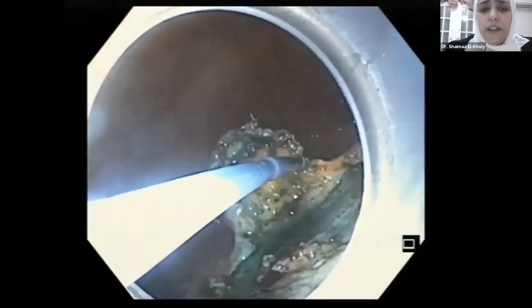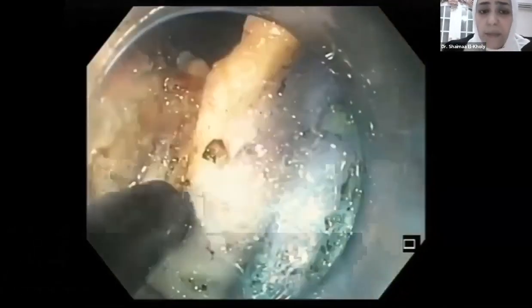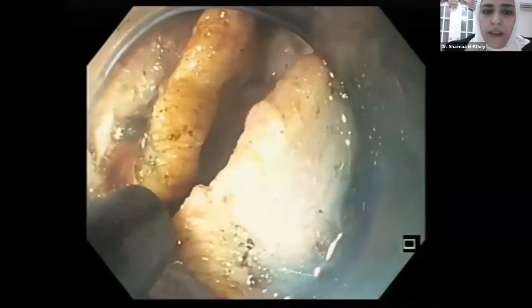It's just the final cut. Here we shift to the IT knife. This IT knife has an insulated tip knife, so we dissect with the shaft of the knife. As you can see here, we are separating the lesion. And here is our final cut.